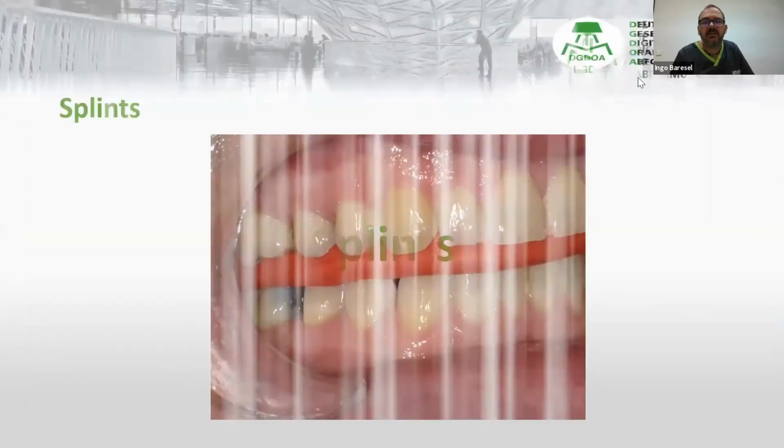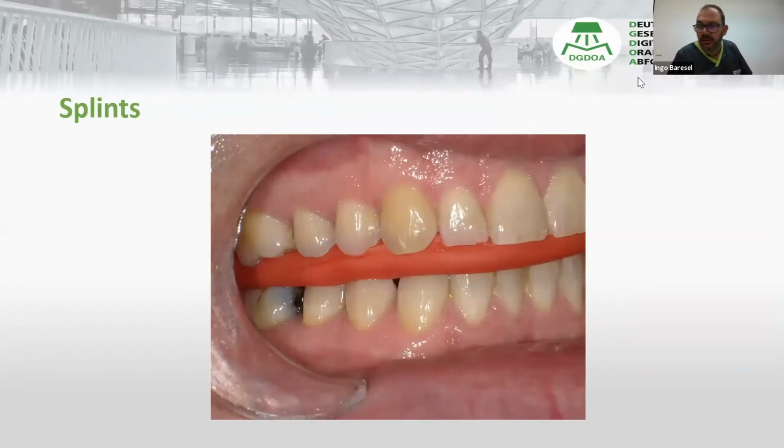And now we talk about splints. I will show you what we're doing now. We will now go to the live scan, and hopefully all what we planned is working. So now we will be going live. I will show you how we're doing splints and how you can do together with DMG, with this really great tool they offer now, and what will be even greater in the future, because they work on many, many fascinating things. We will show you together how you do this in your office, how you do splints in your office.